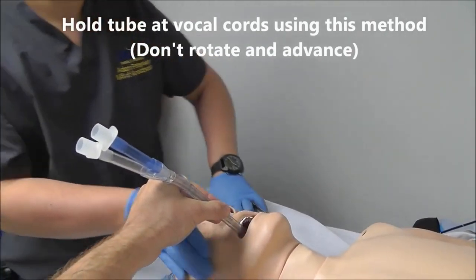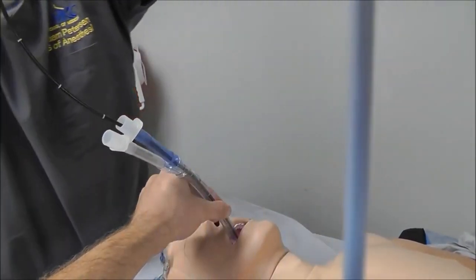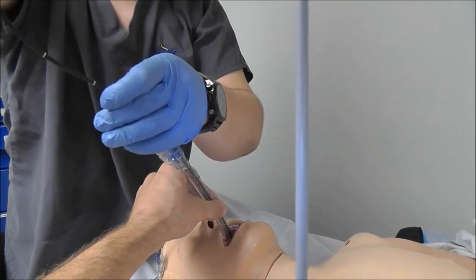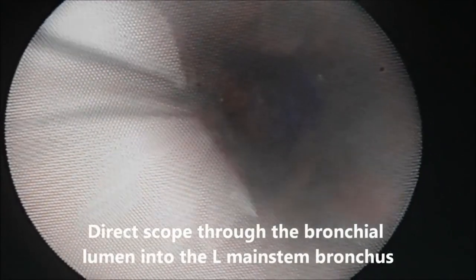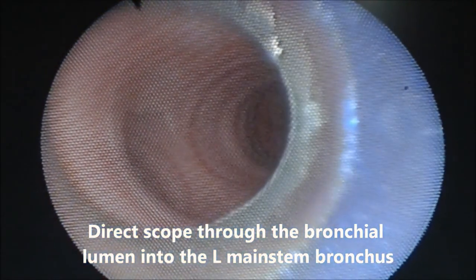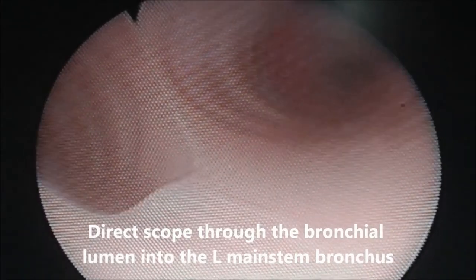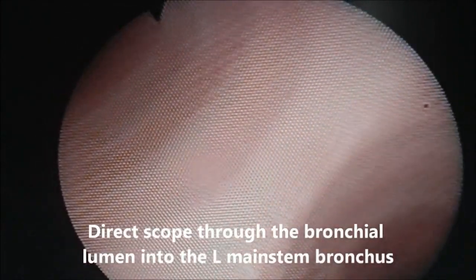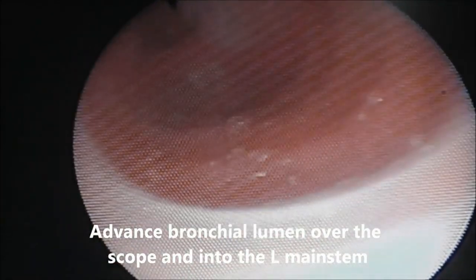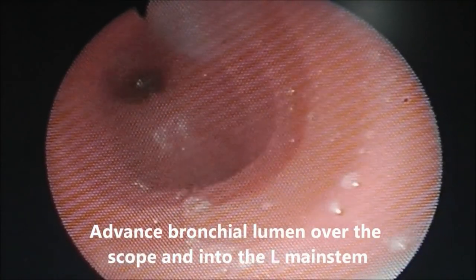You can remove your blade at that point and insert the fiber optic scope through the bronchial lumen. Once I'm in the bronchial lumen, I advance the fiber optic scope past the tube itself. When you exit the tube, you should see the carina in front of you. Advance and direct the scope into the left bronchus. At this point, your assistant can advance the tube over the fiber optic scope into the left bronchus.